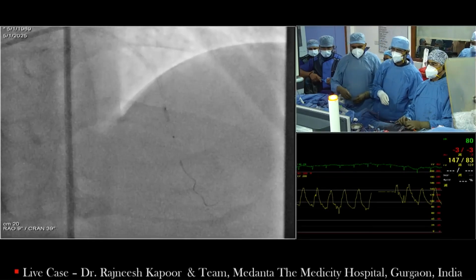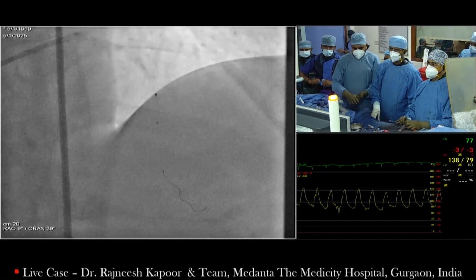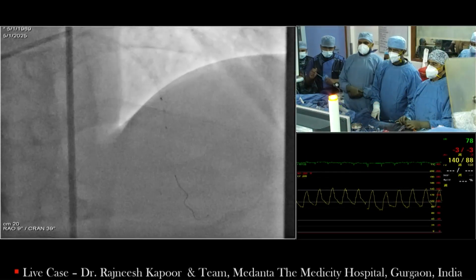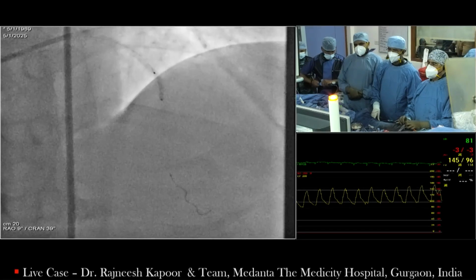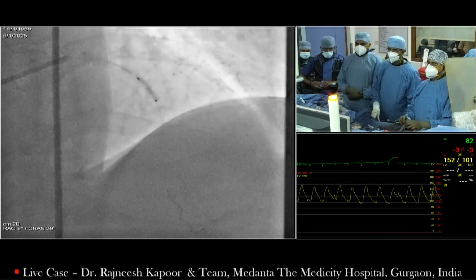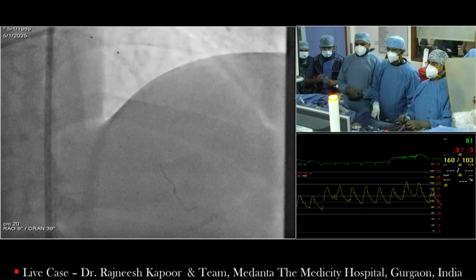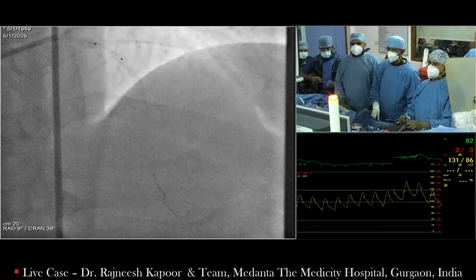If it is superficial thick calcium, atherectomy; for deeper calcium, atherectomy followed by some sort of balloon strategy. Whether you choose an NC balloon or Wolverine at that time, or a Shockwave or an OPN balloon is up to you. But in many of these places, your Shockwave or IVL or OPN will not cross if you have so much superficial calcium.